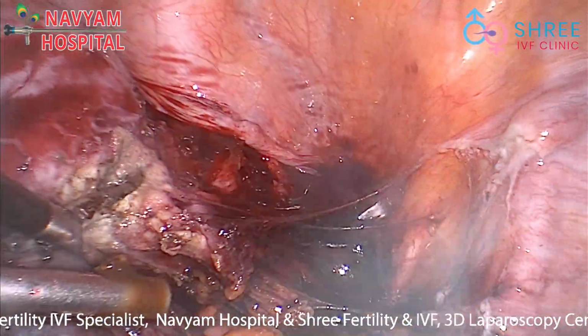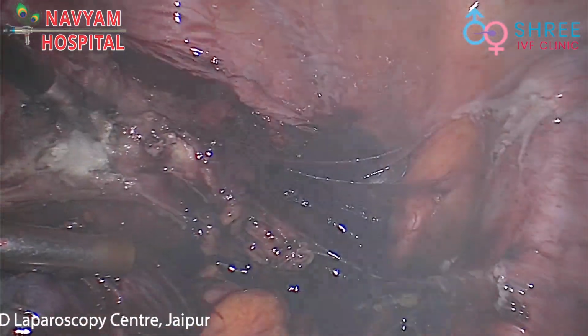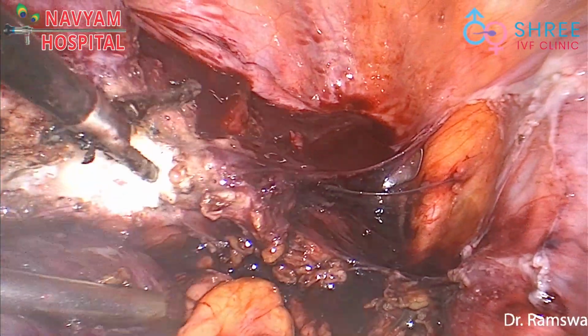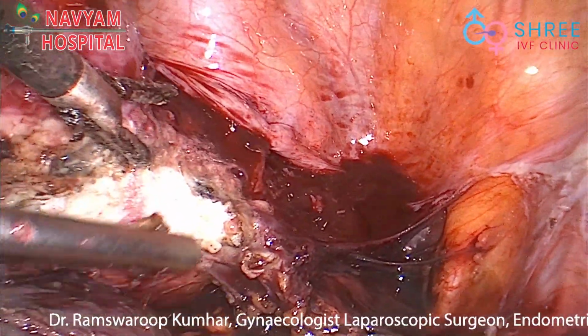Proper coagulation of this vasculature bundle was made, and then these vessels were cut. After cutting these vessels, we have to lateralize them very well till the opening of the vaginal vault at the level of insertion of the uterosacral ligament.